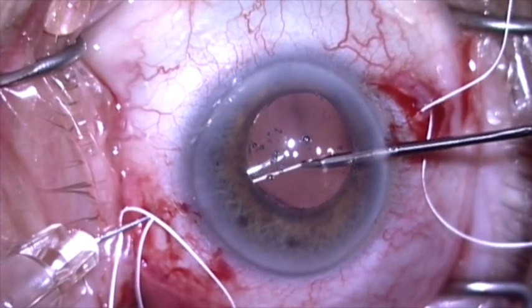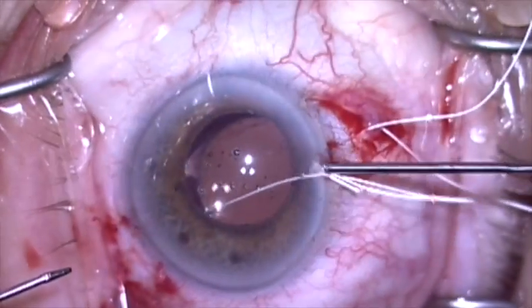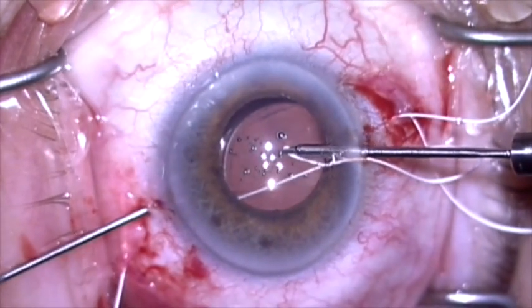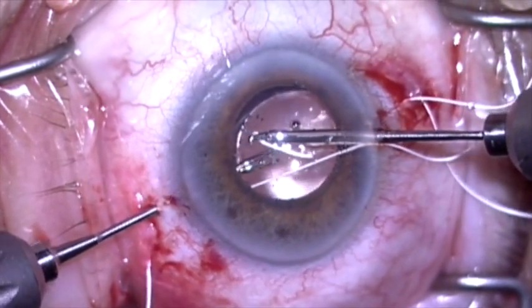Here I'm using my micrograsper to grab the suture, pull it out through the paracentesis, and I'm now going to bring it back in through the paracentesis. I pull it out of the eye to create some slack; otherwise when I try to tighten this it'll pull the lens to that side.